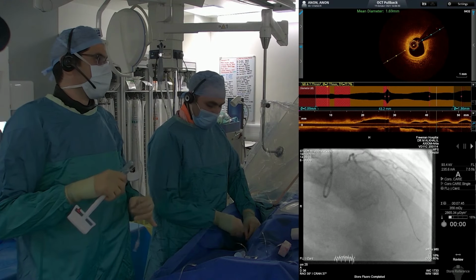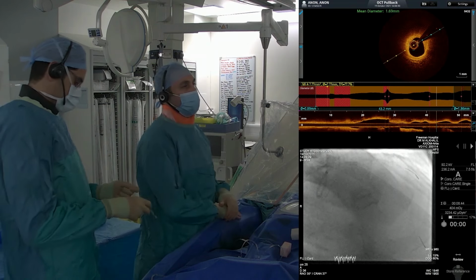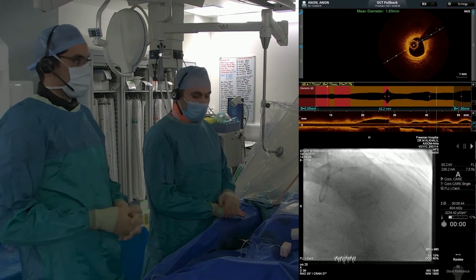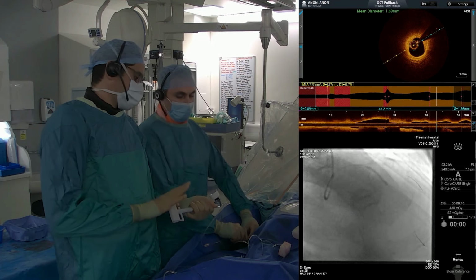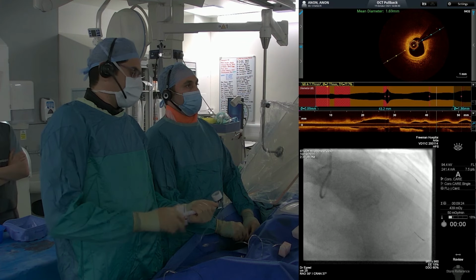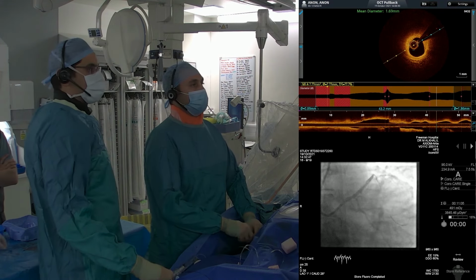We're going to use a 3.0 cutting balloon now for the area within the stent. So we're going to try to put a stent in the mid-LAD distal to the diagonal, and then we're going to overlap that with another stent to come all the way back to the ostium of the LAD. So nominal here is 12 atmospheres. So you have the option of using the balloon markers here to measure the length of the stent up to the ostium. Yeah, so we're going to do that actually. We're going to use the stent balloon for the overlap. We're going up, so the circumflex ostium is not compromised.